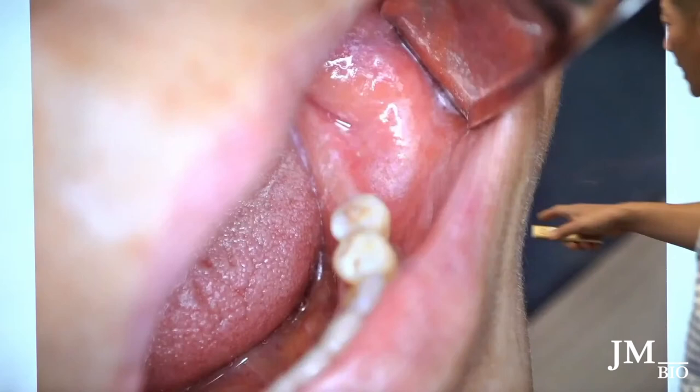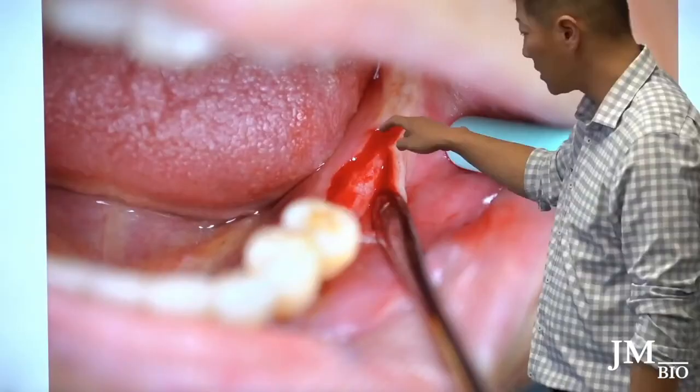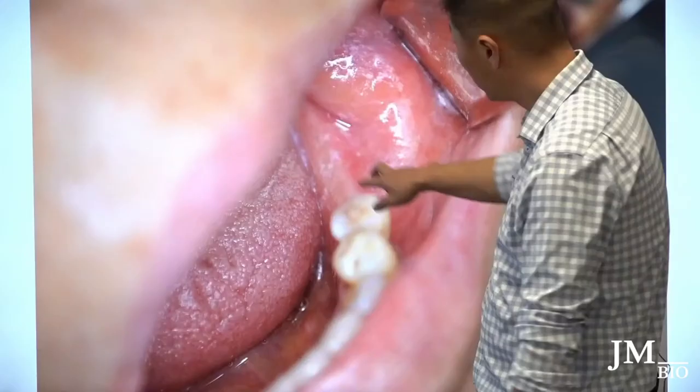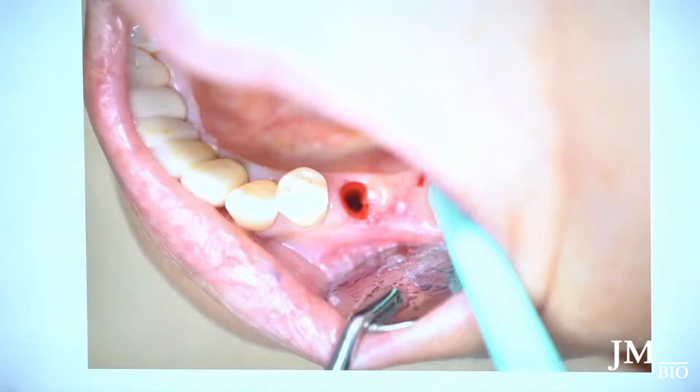For a case involving a bridge, I make a lingual-crestal incision with a buccal hockey-stick relieving incision. It's not on the crest — it's more lingual. The reason is there's not much keratinized tissue and the mucogingival junction is pretty high up, so I want to use the implant and healing abutment to push that keratinized band buccally. The tooth is extracted and I did an immediate placement.